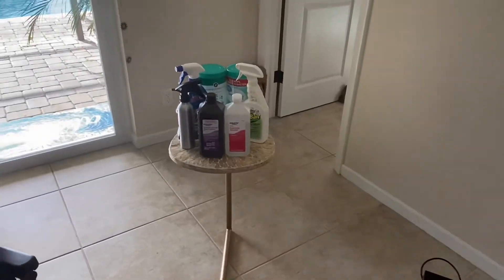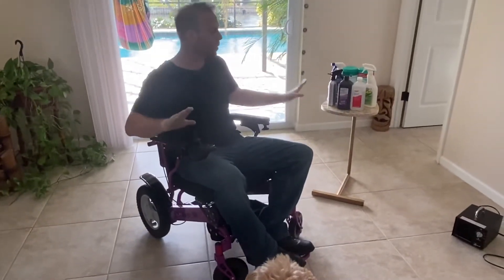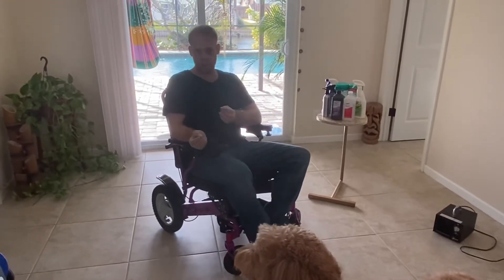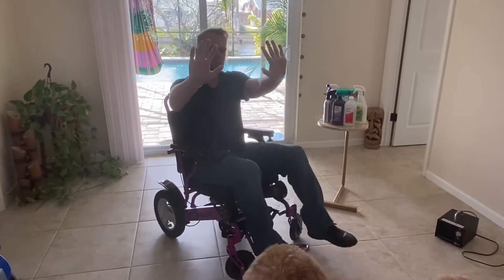A lot of people have questions about how to clean and sanitize your power folding wheelchairs — what works, what doesn't work, what's going to ruin the chair, what's not going to ruin the chair, and what's going to keep you most effectively safe.